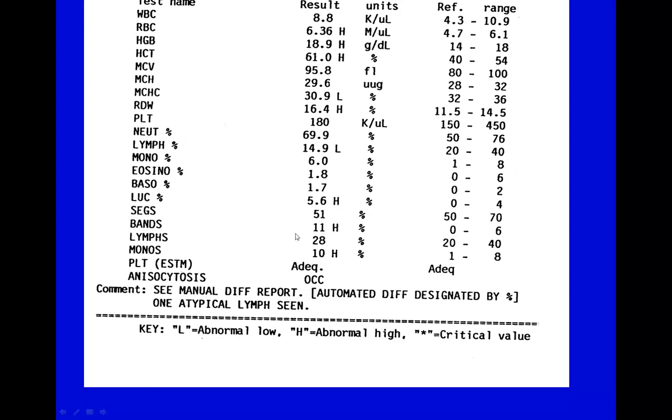So do you see how an acute infection could lead to a chronic infection? And we might have both a right shift and a left shift. Right now we just have a left shift. The bands are elevated above their normal. A right shift would be the segmented neutrophils are elevated above their normal, and they're not yet. The monocytes are elevated. Maybe you have a fungal infection going on as well.